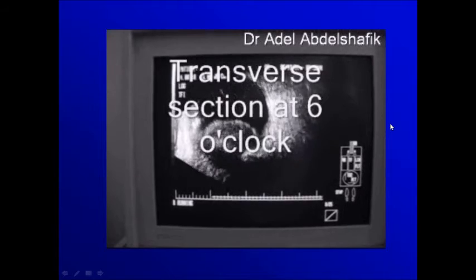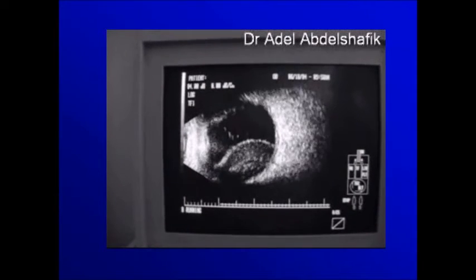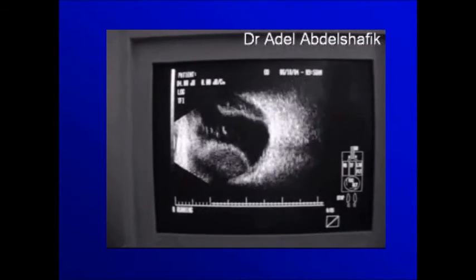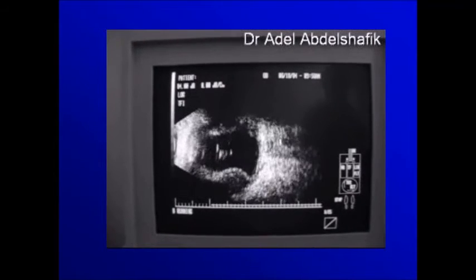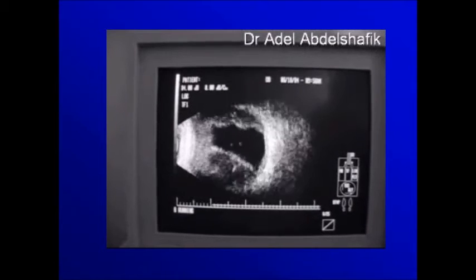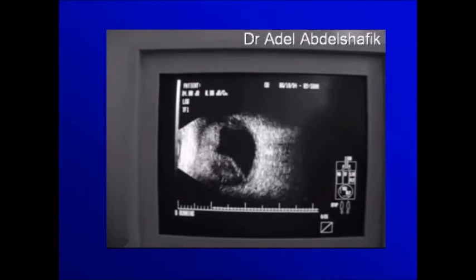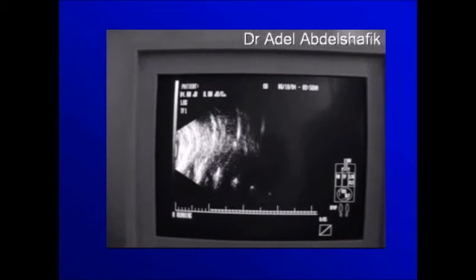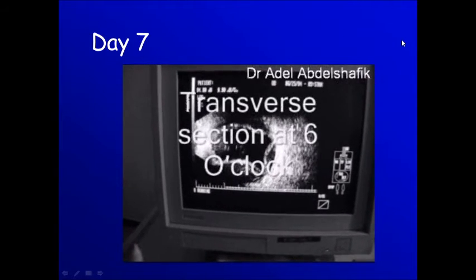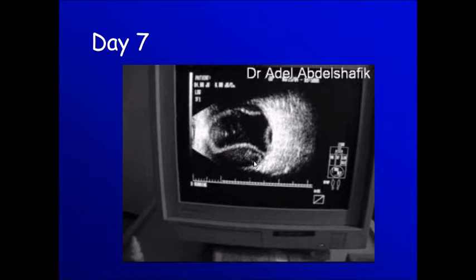Another example with hemorrhagic choroidal detachment. This is a postoperative case following cataract and glaucoma surgery. After a week, in the same patient, you notice some translucent areas inside the choroidal detachment. This is a sort of hemolysis.